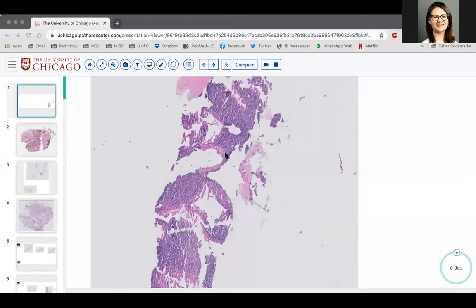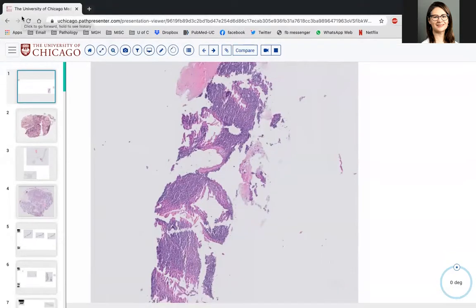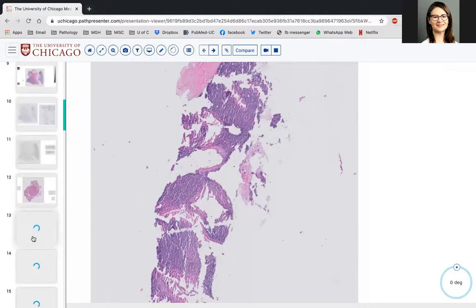I wanted to thank Katie for helping out immensely with putting together this presentation, ranging from biopsies to subsequent resections, as well as relevant immunostains. I hope you can all see my screen. I made the presentation full screen, so hopefully that will help enlarge it. We are happy to provide the full presentation, which I'm going to go through today.